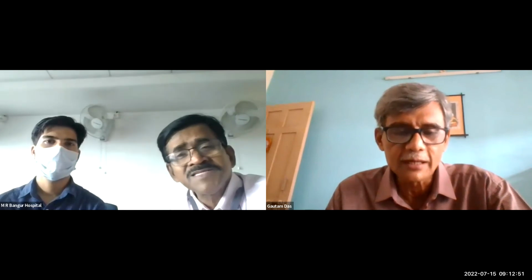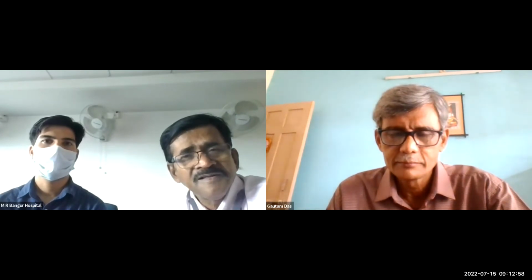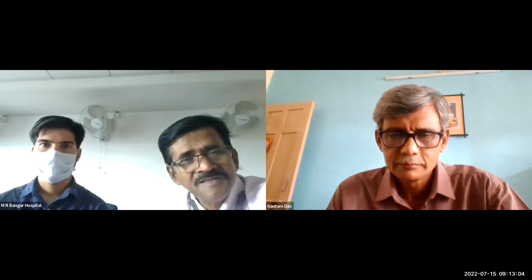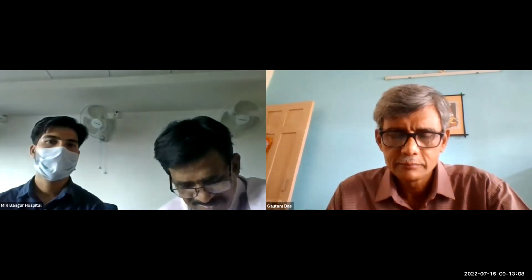I want to mention two things. I think the postgraduate student should tell about bile leak from the liver bed and venous sinus bleeding as complications of laparoscopic cholecystectomy, because these are two tedious situations which we face.